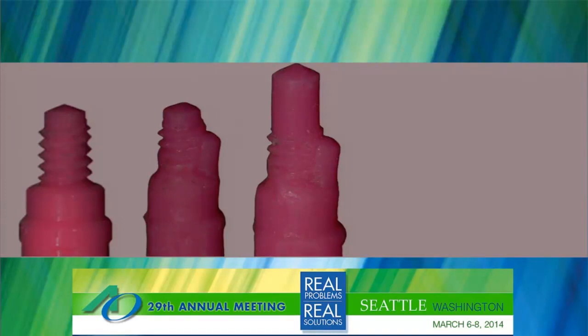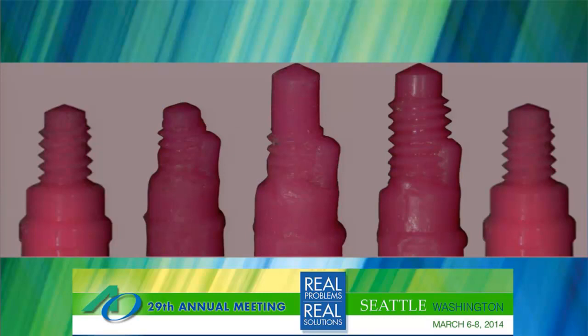It just so happens that's possible because a metric 1.8 screw and a metric 1.6 screw carry the same thread pitch at 0.35. So it's a bit of a challenge to pull this off, but with the same guides that I used to take the screw out, I was able to drill the pre-drill deeper by 1.3 millimeters, as shown on this right side image, and then retap the implant to metric 1.8. And you can see now that I have about 3.5 brand new threads above the damage, and the threads that were damaged before are now cleaned up quite significantly. And we have an implant now that is re-restorable, and that's great.